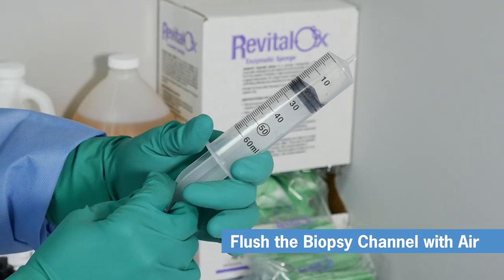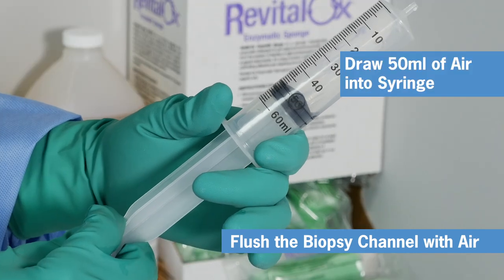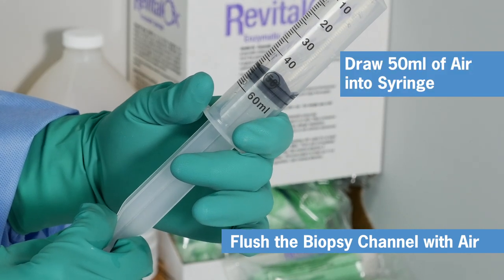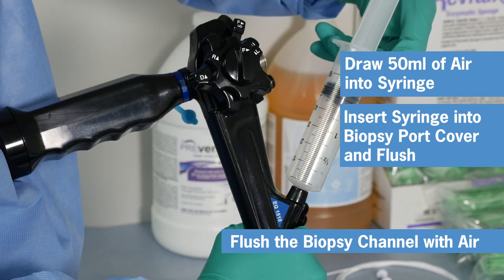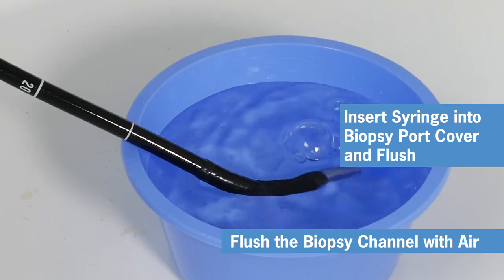Now repeat the process flushing with air. Draw 50 milliliters of air into the syringe and repeat the flush process three to four times as needed to flush out any obstructions in the channel.